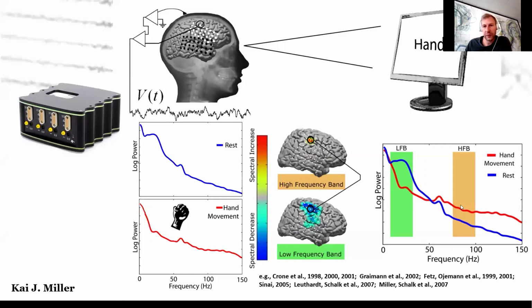And in some connected studies, we can actually see that this broadband activation is related to the neural firing rate, and also co-localizes with a BOLD response in fMRI. So this is a direct marker actually for the neuron firing rate underneath this cortex, whereas the low frequency suppression can be more considered as a conditioning of the cortex so that it's easier excitable, and this can be related to an anticipation effect of the upcoming task.